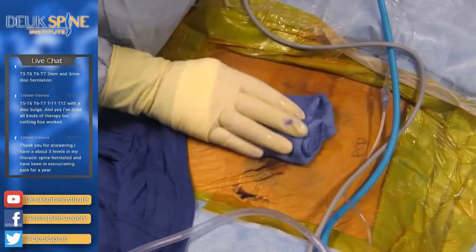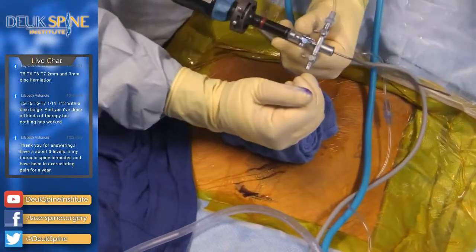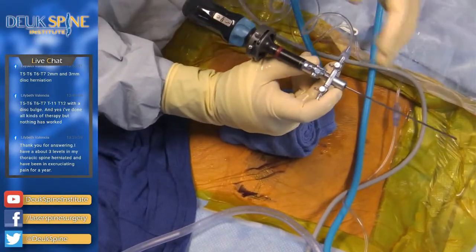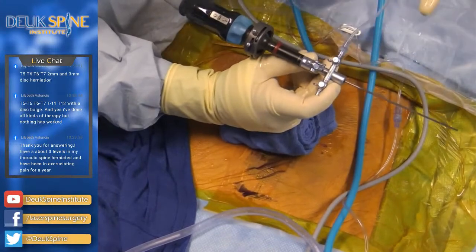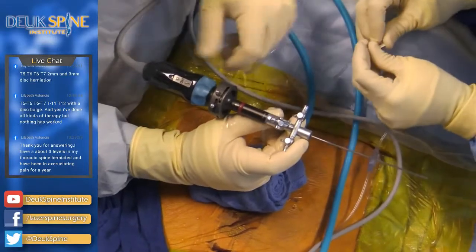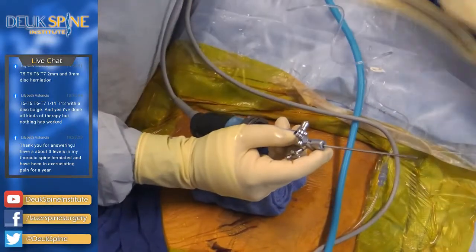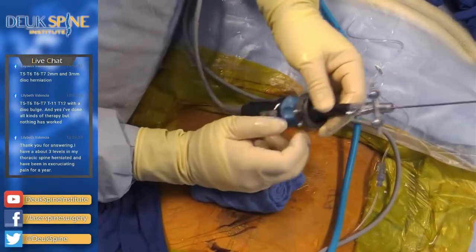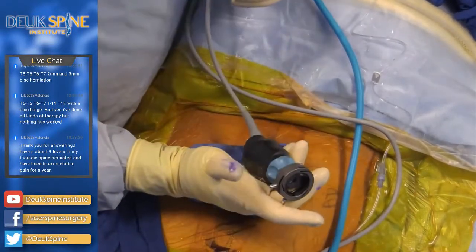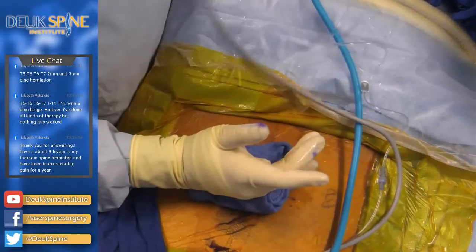And for those of you wanting to see our rig, this is our rig right here, the endoscopic rig. When somebody asked a question earlier about damaging their rig, this is the part they were talking about. You have irrigation coming in from the side, and the laser fiber goes through there. You have a light source right here, and the camera attaches to the back of the scope. This is a high definition camera. Again, only the best equipment.